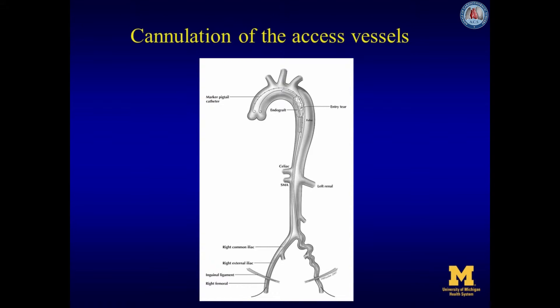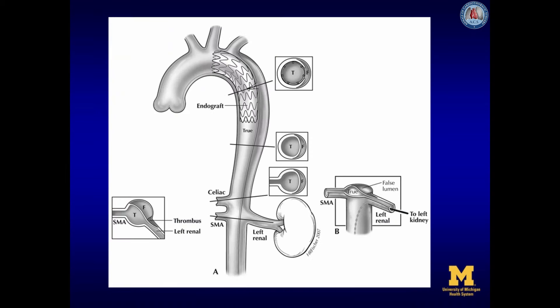After IVUS examination and initial angiography of the arch to determine great vessel origin, the access vessels are cannulated. The tortuous left iliac artery serves as the route for percutaneous placement of a marker pigtail catheter used for angiography and marking the site of deployment. Through open exposure of the right femoral artery, the delivery sheath is placed into the terminal aorta over a stiff Lunderquist wire, maintained typically in the ascending aorta. It is critical to ensure true lumen placement of both wires to avoid catastrophic complications of false lumen stent graft deployment or extension of dissection to a type A.